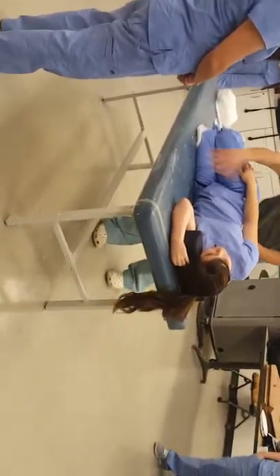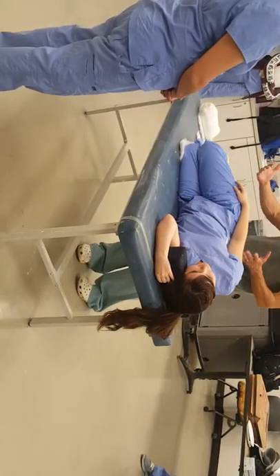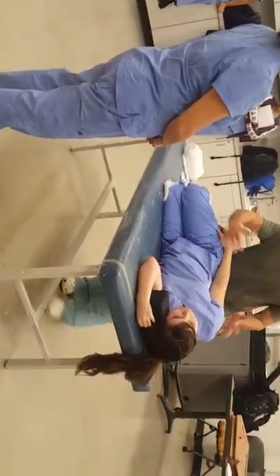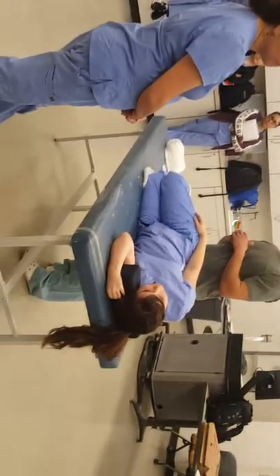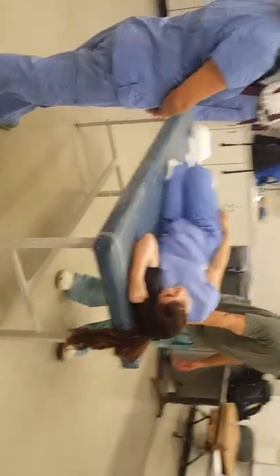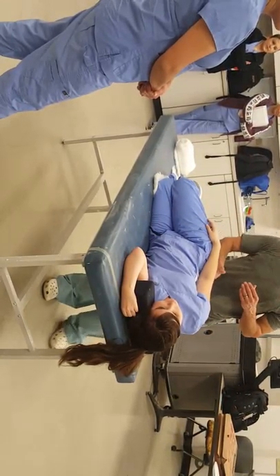Once I got the patient up, I will tape the patient down too. I take tape and tape right over the ASIS to hold the patient from going forward or backwards. This patient will probably be on some type of positioner or bean bag — it's a bean bag that they're laying on. Once I've got them in the right position, I fold the bean bag up, pack all the beans up against her, and suck all the air out so it totally molds to her and keeps her in a lateral position.